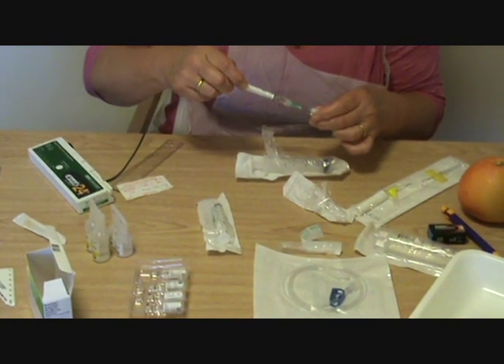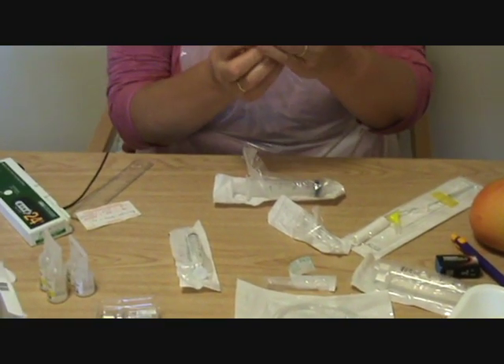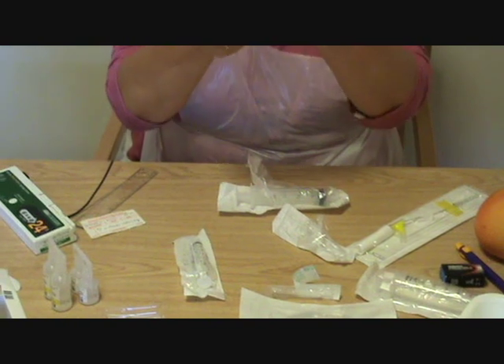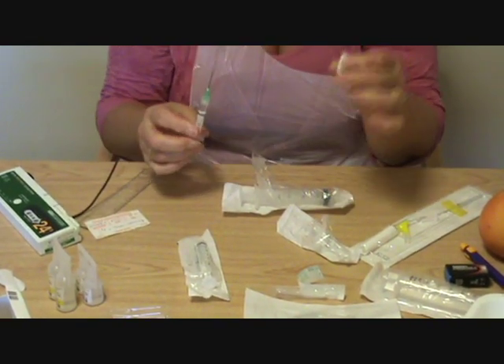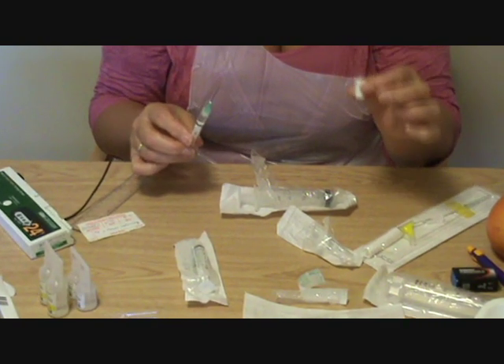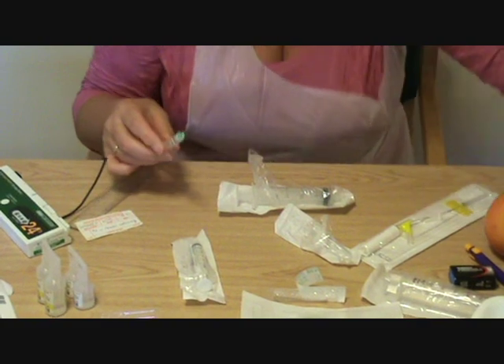This is 20mg of buscopan in 1ml and I'm drawing it up in a smaller syringe so that I can see that it is 1ml — and it is. But sometimes you'll find that there's more of the drug in there, and you want to be accurate, so using it in a separate syringe can be really helpful.